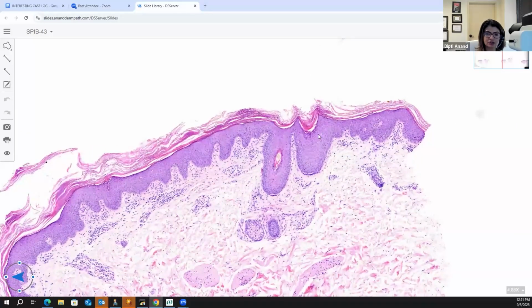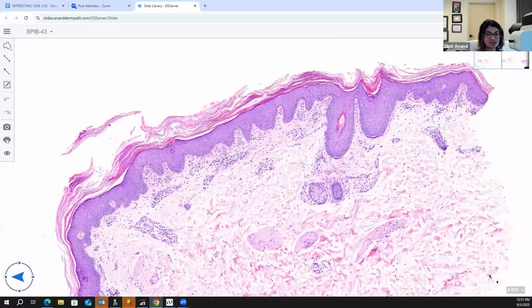The reason is that you start here with follicular plugging happening and the epidermis is thick. The cornified layer is not just in mounds, but even in between, it is orthohyperkeratotic. And PR should not do that. PR is a very subtle process. If the mounds are there, it's just the mounds. There aren't significant changes involving the epidermis in the background. So this would not be PR.